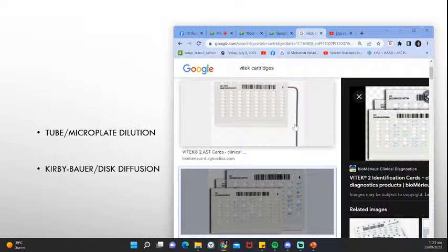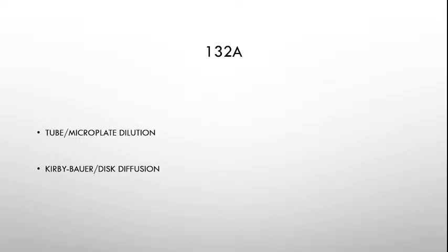So basically, there's a small plate there that determines the turbidity of your particular sample. Okay, so the determination of resistance and susceptibility is essentially attributed to the turbidity of each plate. So it's light technology that allows the machine to give an interpretation of whether it's resistant or intermediate. So we no longer measure it with a ruler. I think you've seen those things in the books.